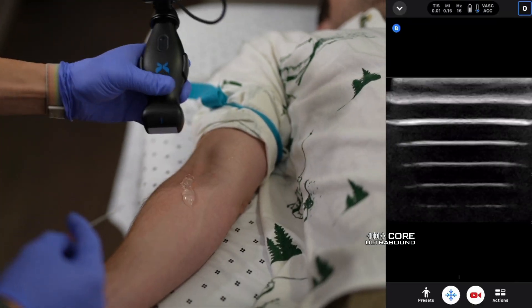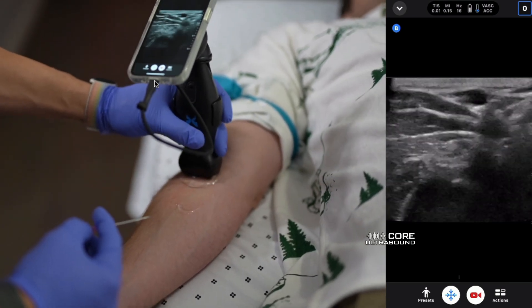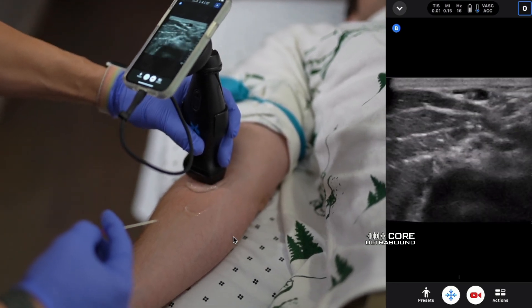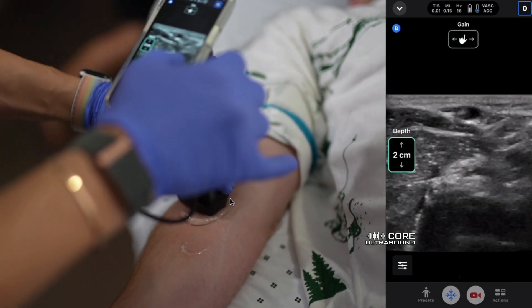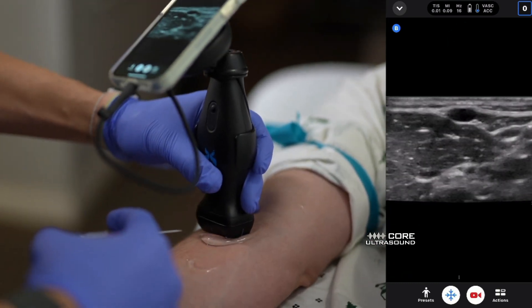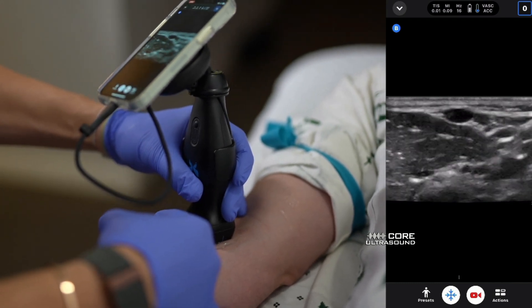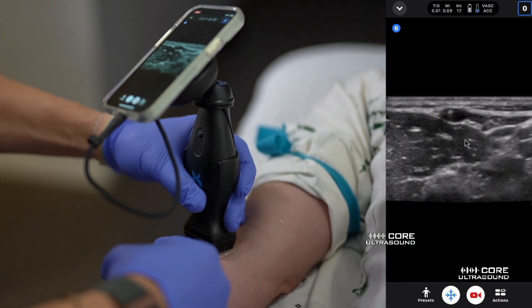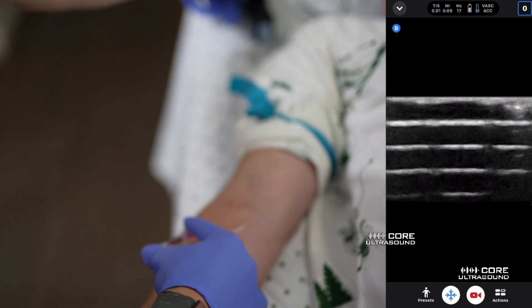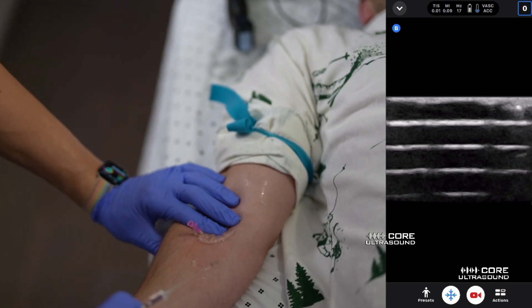You can also do this with ultrasound-guided IVs. Here I have it at a non-90-degree angle relative to the IV so I can actually not worry about that cable — which is obviously super important if you're leaving the cannula in there, so you don't touch that cable since it's not necessarily clean. On this patient, they definitely do not need an ultrasound-guided IV — it's quite superficial — but this is just to show how useful the Oculine is with visualization while performing procedures such as ultrasound-guided IVs and nerve blocks. You can see a successful cannulation with good visualization using the Oculine.